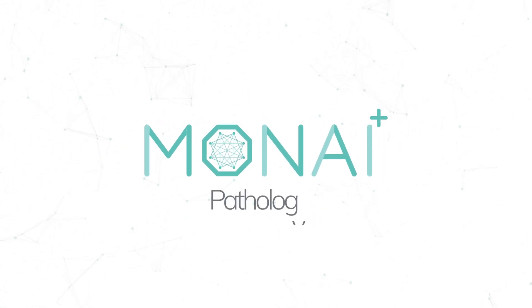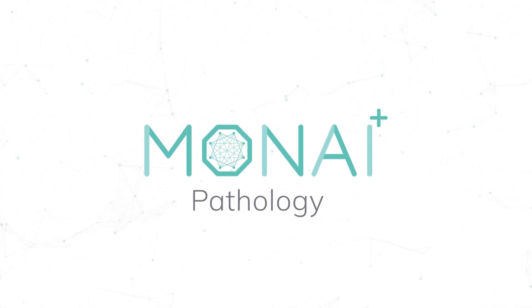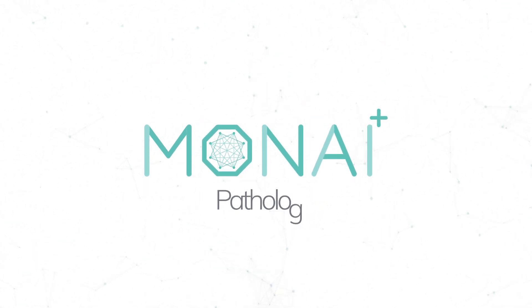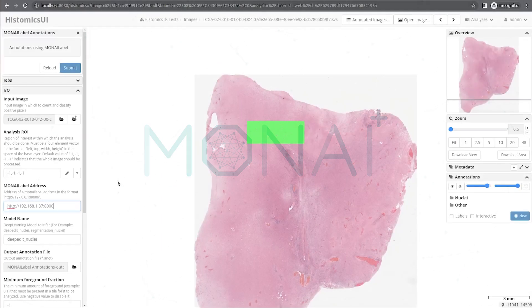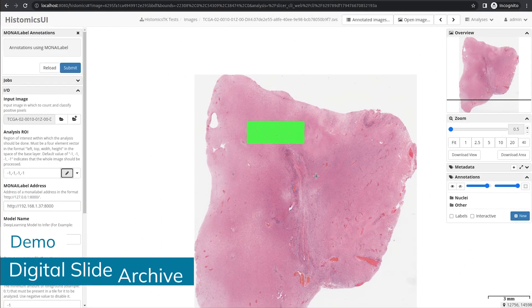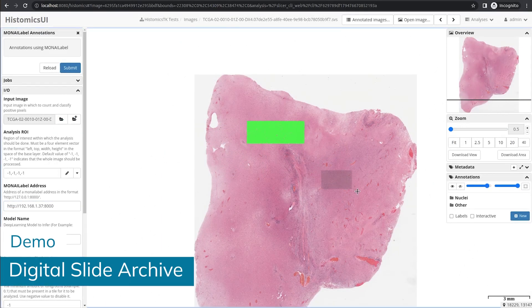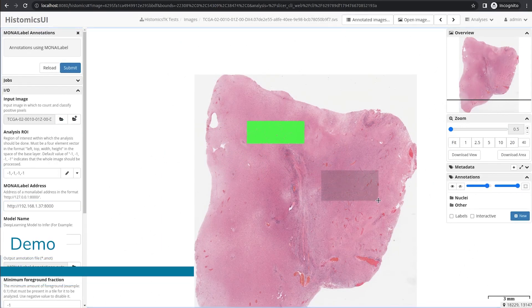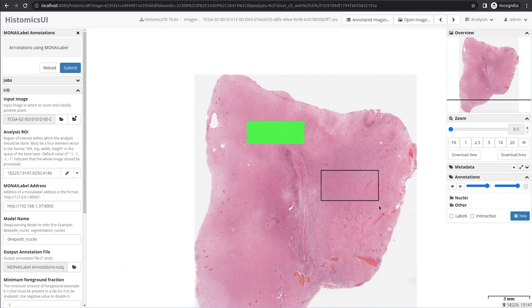Project Moni is continuing to expand into the field of pathology. With our latest releases this summer, new features and integrations are happening within MoniLabel. Let's take a look.